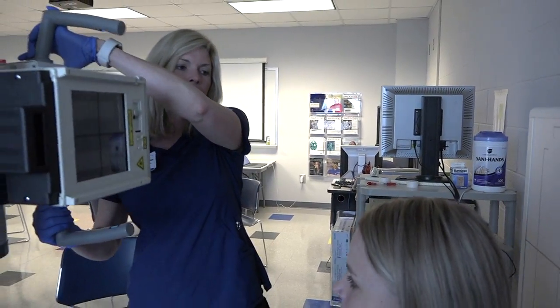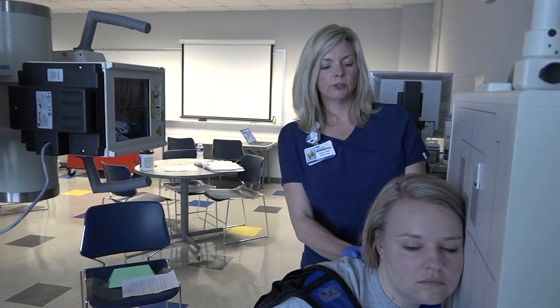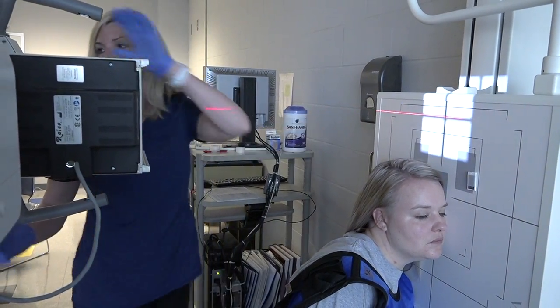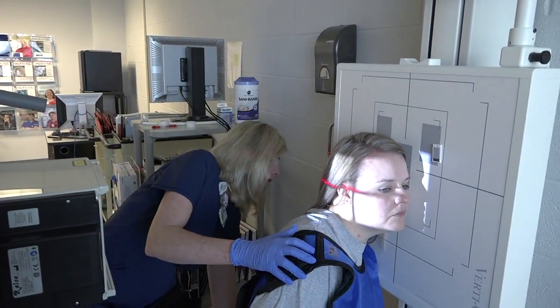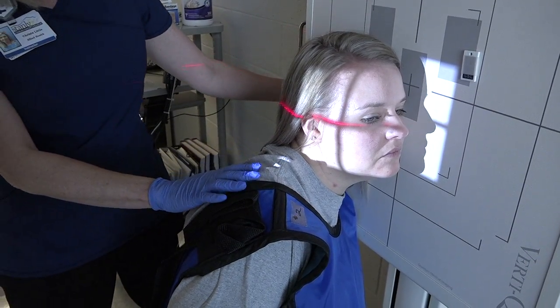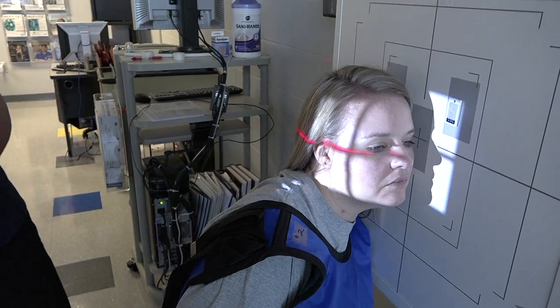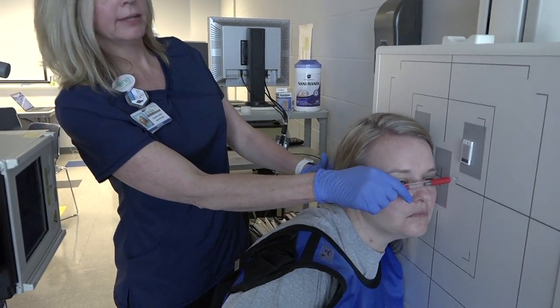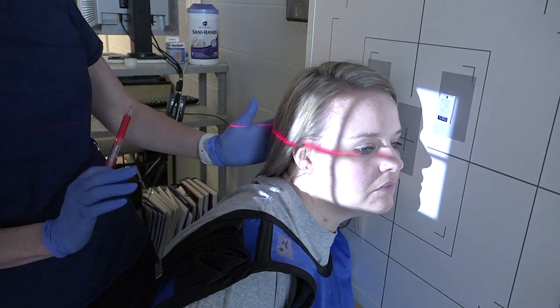We're going to say her left side is hurting, so we'll put her left side against the board and get her shoulders out of the way. Our centering is to the zygoma or cheekbone, so we'll slide her stool back just a tad. With our lateral, we want to see that the IPL — our interpupillary line — is perpendicular to the image receptor. It's important to line that up to prevent any rotation or tilt.